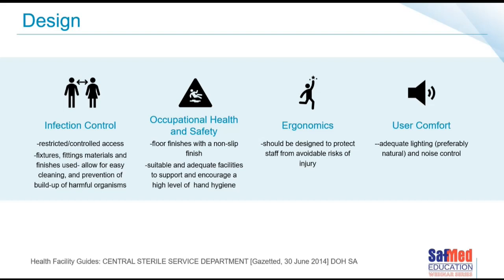Touching on some of the points that they raise, under infection control, some of the things that popped out for me were restricted controlled access. Restricted controlled access, in fact, applies to CSSD itself and, of course, the sterile storage zone and area. There's a lot of focus on the fixtures, the fittings and the materials and the finishes that we should be using in the design of these areas, because all of those fixtures, fittings and finishes must allow for easy cleaning and, importantly, a prevention of buildup of harmful microorganisms.